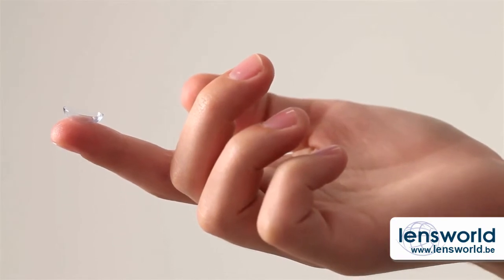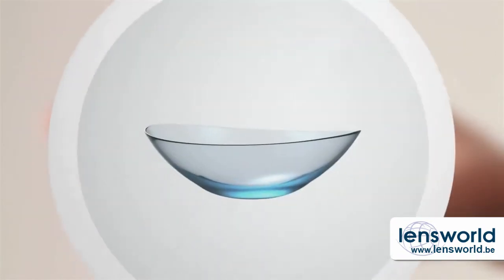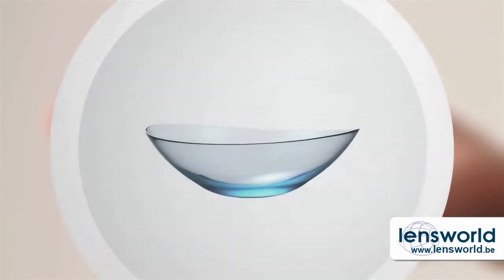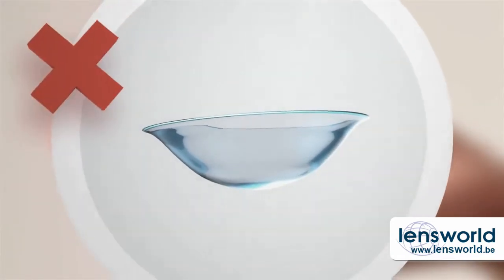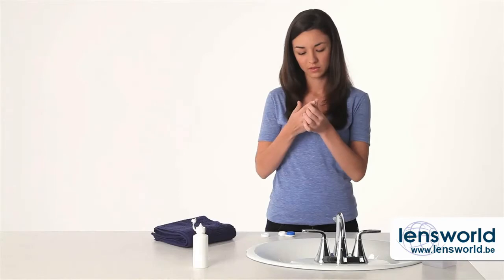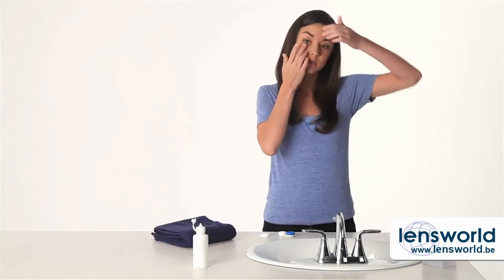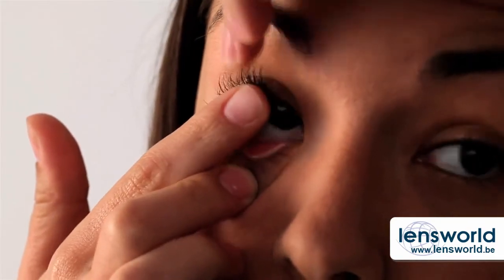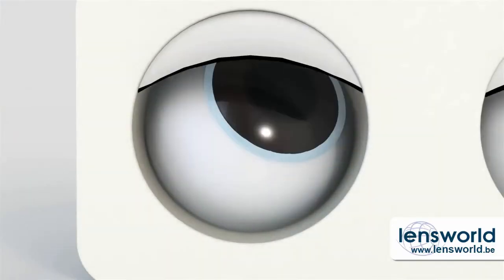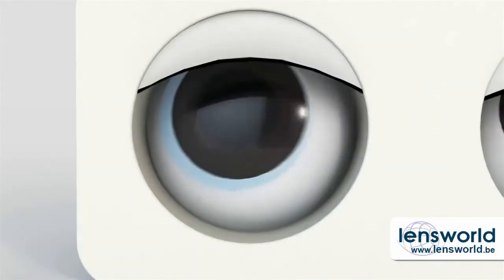Making sure your fingers are dry, put the lens on the tip of your finger and take a close look. If it's shaped like a little bowl with a nice straight edge, you're good. If the edge curves outward, it's inside out — flip it. Use your lens hand to pull down your lower lid. Using your other hand, hold your upper eyelid. Gently place the lens on your eye. You can put it right on the center of your eye or on the white part just underneath — whichever feels best.